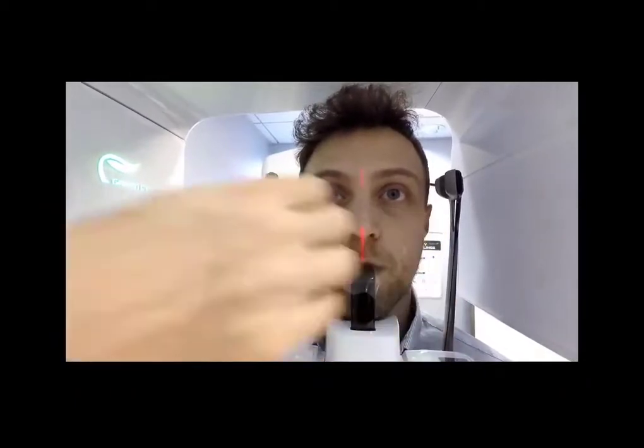If it's off by a little bit, touch the patient's face and slide it off here, in this case a little bit to his left, and line it up properly there. So I'm going through the middle of the patient's face just like that.